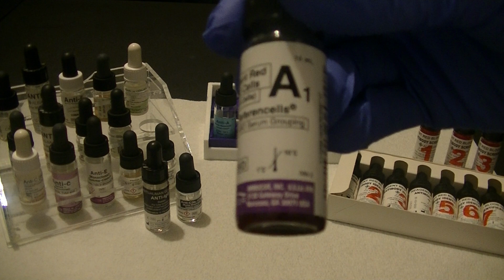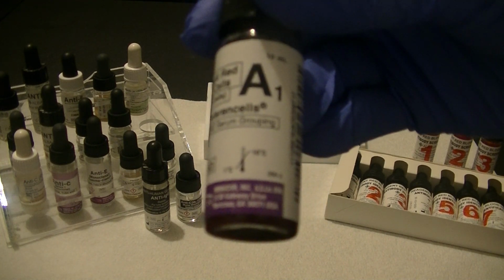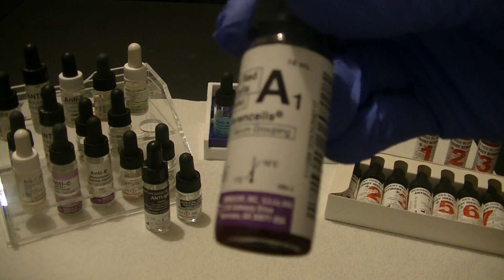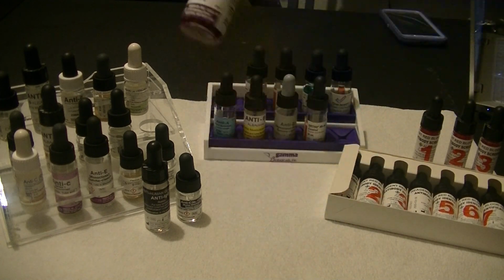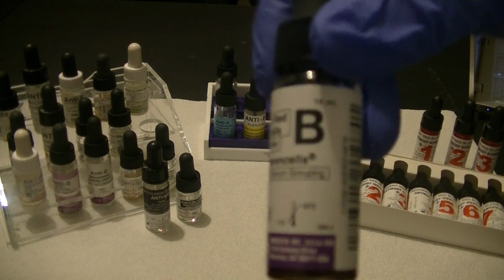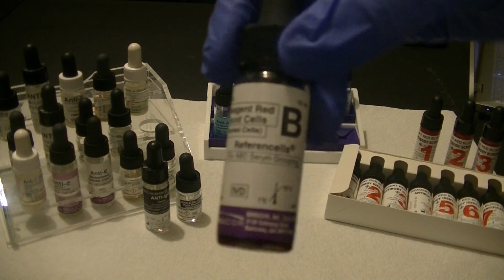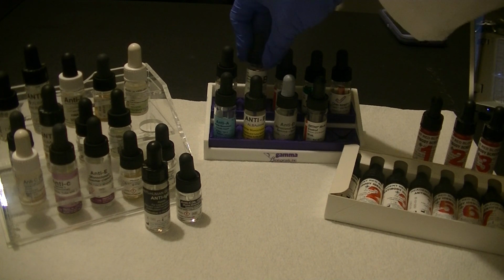A person who does not have the A antigen will have A antibodies, and when we mix that person's plasma with these A red blood cells that are reagent cells, it will cause agglutination. People that do not have the B antigen on their cells will always have the B antibody in their plasma, and when we mix their plasma with these B reagent red cells, we will see agglutination.